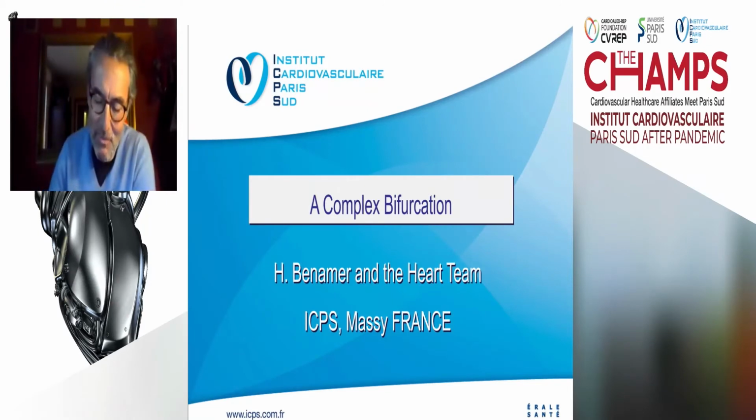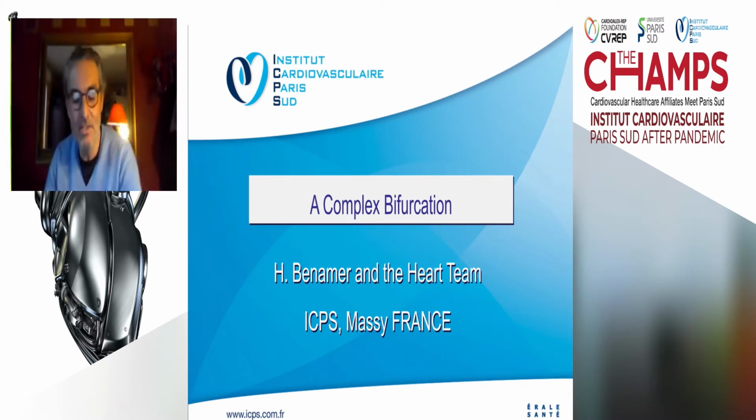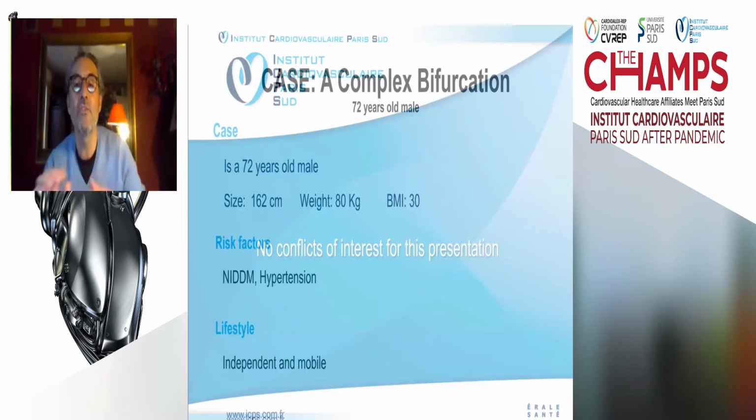Hello everybody. I'm very happy to be here and to give you a talk about a complex bifurcation. We will put into practice what Thierry said just before with this live case. We did this case 2 years ago for the Euro PCR. So I have no conflict of interest with that.